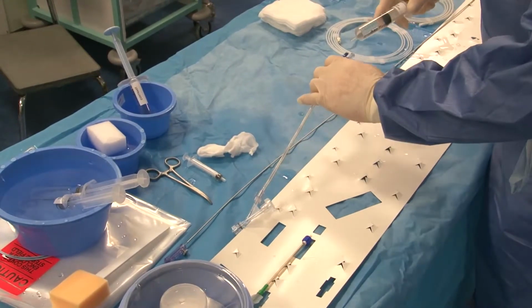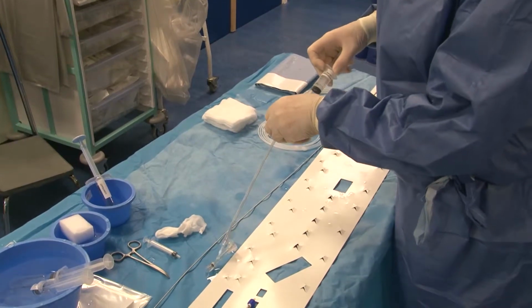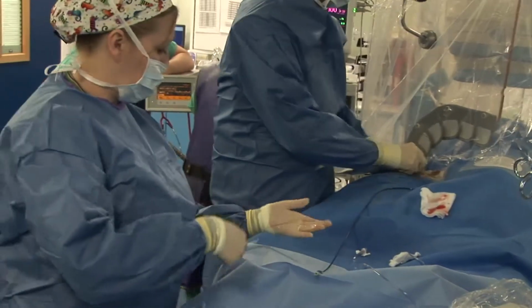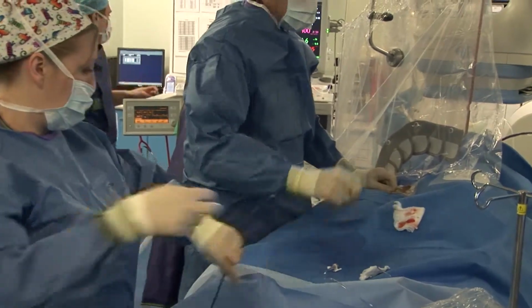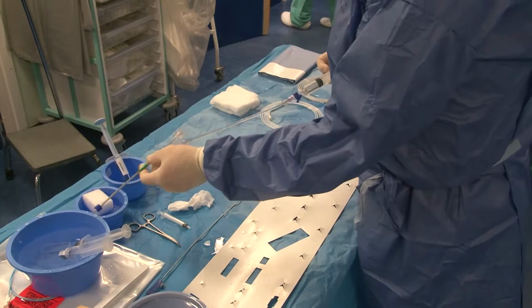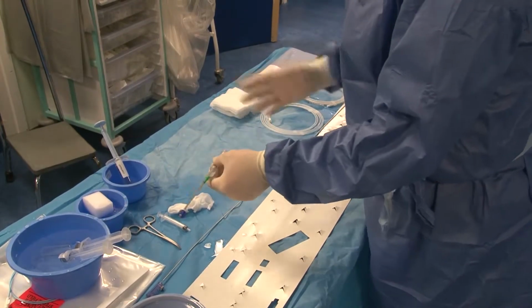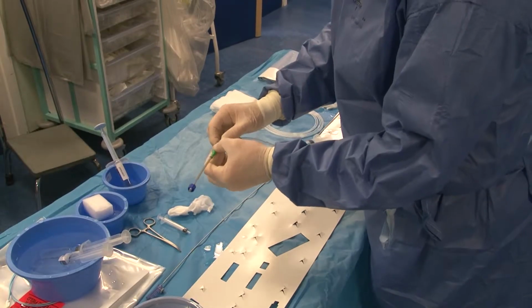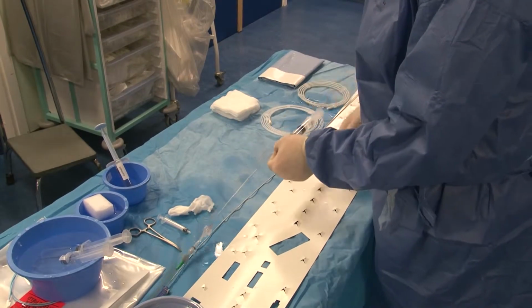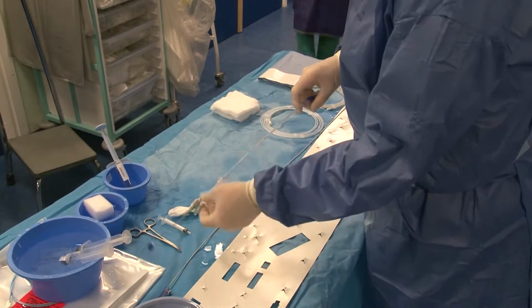The important thing with this is really to make sure everything's really well flushed, and if you're not careful, you can get air embolism. We want to make sure the device and all the catheter and equipment is really well flushed, and that we don't have any air in the system. One of the first things to check is that all of these joins are secure. They don't come out of here necessarily secure, so there's three joins in the system.